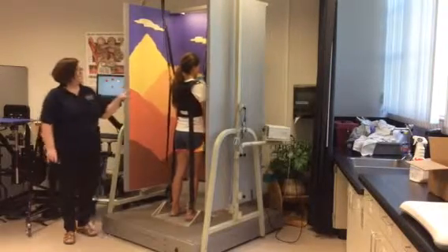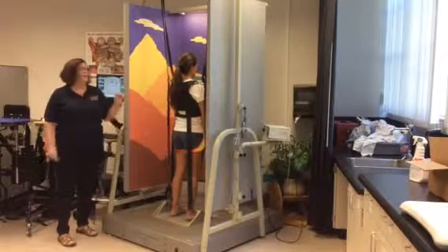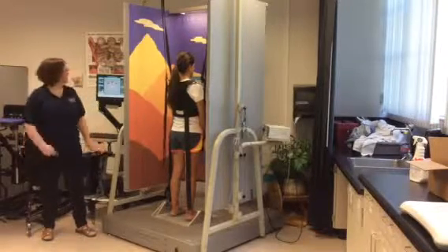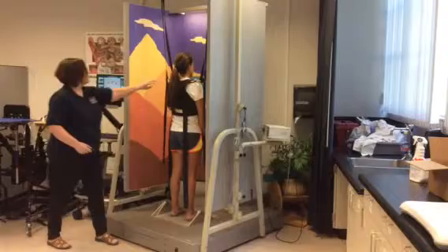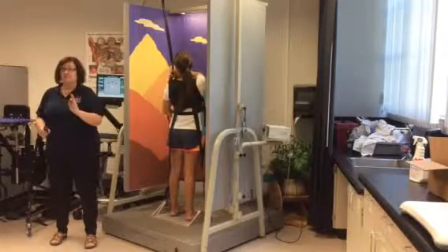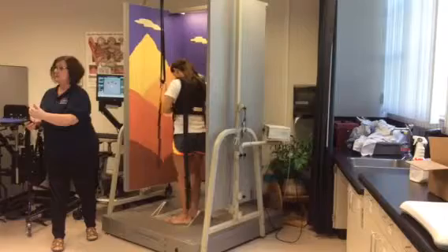Do I get my geriatric individuals to 160%? Occasionally, but very rarely, maybe one. Do I get my geriatric individuals to 100%? Yeah. Sure. Yes, that's my goal. Absolutely I do. So I won't put it on random, but I can actually make it do whatever it wants. And that is real life, right? So I actually work very hard to get to random settings as I get someone close to community reentry.